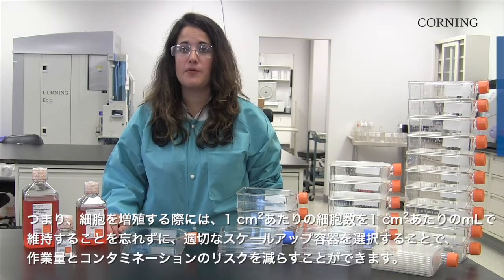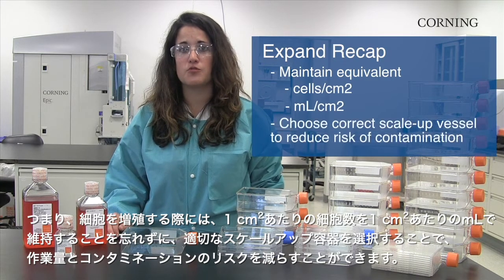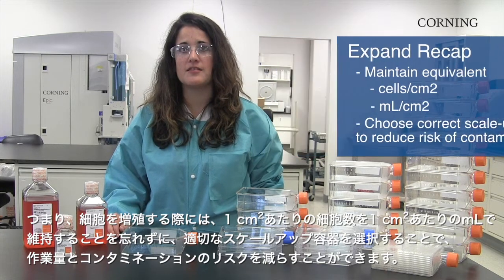So to recap, when expanding cells, remember to maintain equivalent cells per centimeter squared and mL per centimeter squared, and reduce the amount of work and risk of contamination by choosing the correct scale-up vessel.